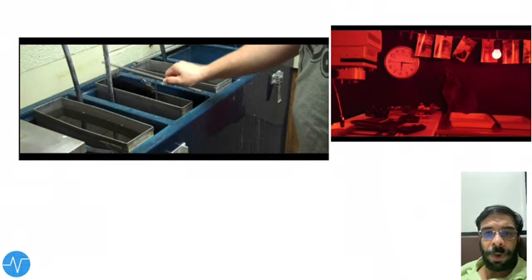Then we keep it in the fourth container, which is fixer neutralization, to remove any residual fixer present. Then we keep it in water to wash it, and then we hang it to dry, like the image seen on the right side. This is the process by which, in the dark room in earlier times, X-rays were made on the plate.